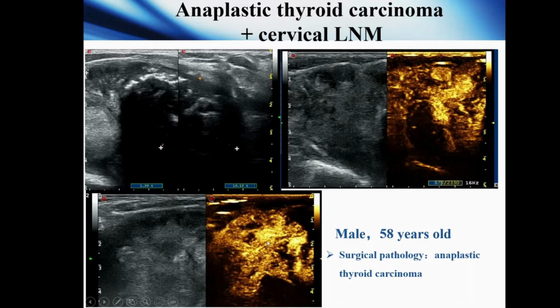The enhancement lasts a long time. The final pathology is anaplastic thyroid carcinoma with lymph node metastasis.